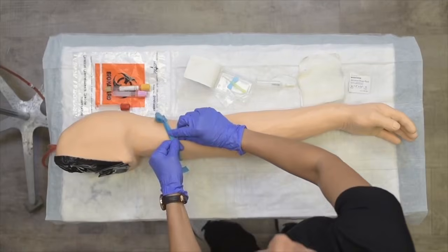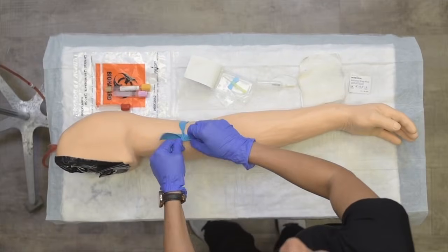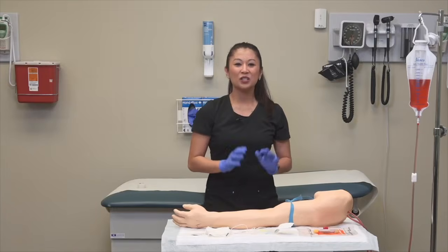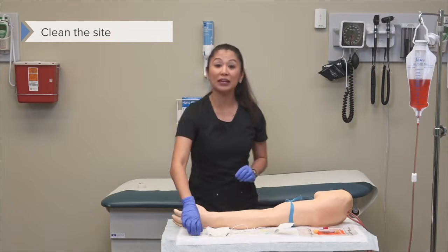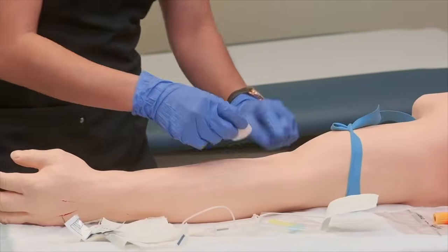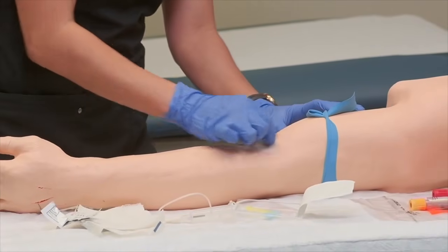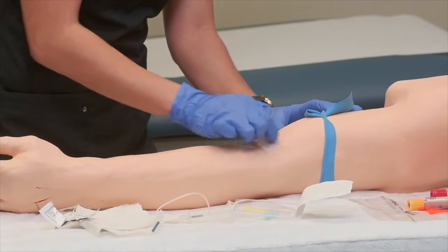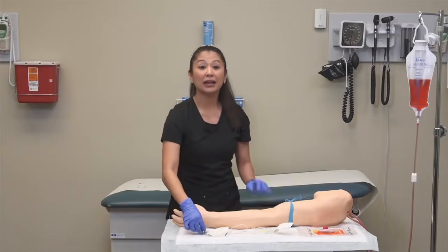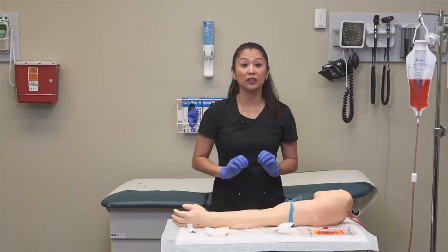Then I'm going to take the tail and poke this to where it does not go all the way through and leave that there. So once we've got the tourniquet, now I can clean my site. I'm going to take my alcohol pad and go here and make sure that I thoroughly clean with the alcohol swab. And it's important here to make sure you let this dry.